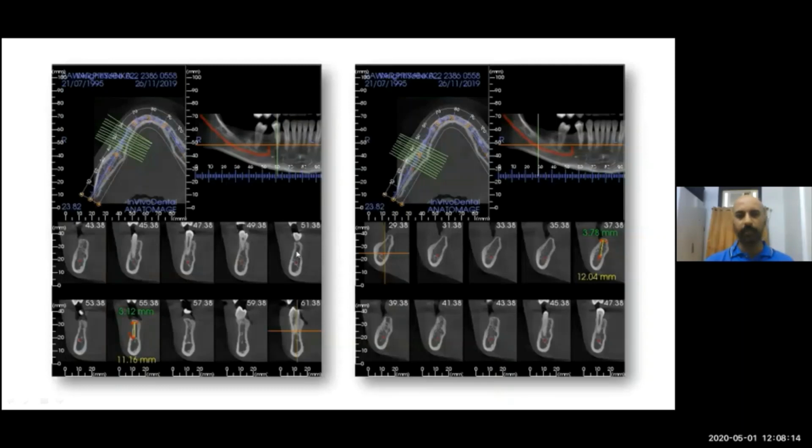The trabecular pattern seems to be fairly regular throughout the area. But this is not the area of interest. This was just an illustration for us to understand how to look at this CBCT scan. Now we shift our focus to this image, which is the CBCT slices of this particular molar region, the edentulous space distal to the second premolar. So this is the second premolar, and we'll be interpreting this like this.